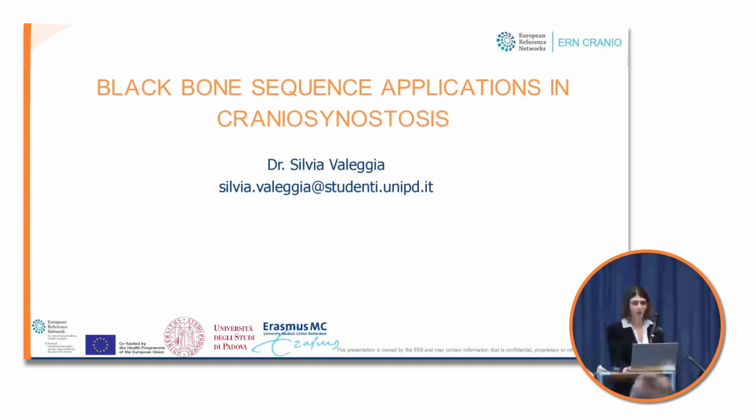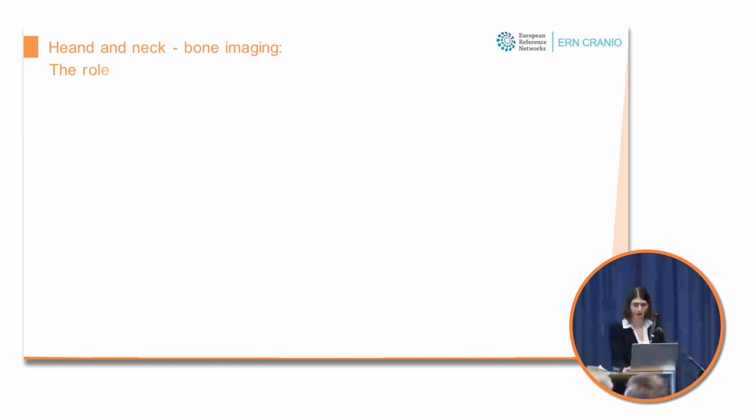When imaging the bone in the head and neck region of a craniosynostosis patient, computed tomography is usually the exam of choice. CT is widely available. It has a short acquisition time.